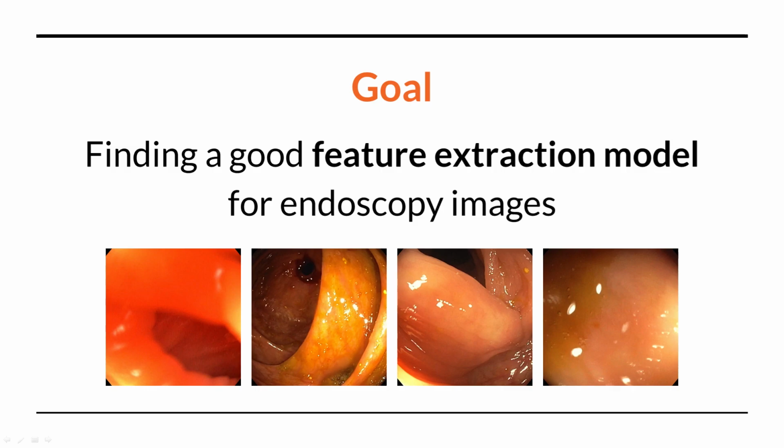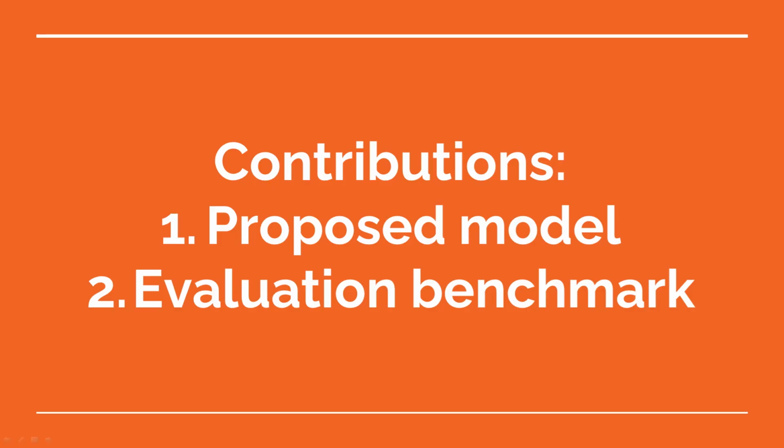This problem is really hard because of frequent occlusions, blur, liquids, and specular reflections that hinder visibility. The main contributions of the paper are both the proposed model for this task and the evaluation benchmark we created to validate this and other models. We'll start with the model, which is based on the deep learning framework called SuperPoint.